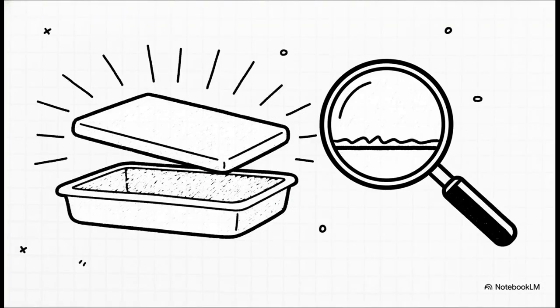Let's ground this concept using a fictional case study, the NeoCath Secure. Imagine a scenario. Let's call it change SC06, where a new lid material supplier and a revised sealer are suddenly introduced. This clearly impacts seal integrity and EO breathability, right? Now, the proportional response here isn't to freak out and rerun the entire original PQ. No, it's to conduct a partial revalidation targeted specifically at the packaging and that breathability. It's a perfect example of addressing the risk scientifically without any unnecessary overreaction. And in this case, it actually fixed a notification gap in their supplier agreement.